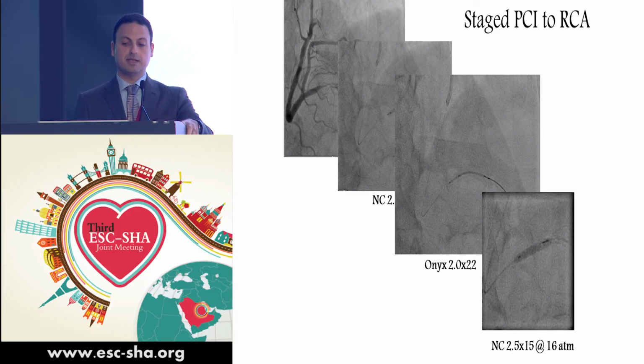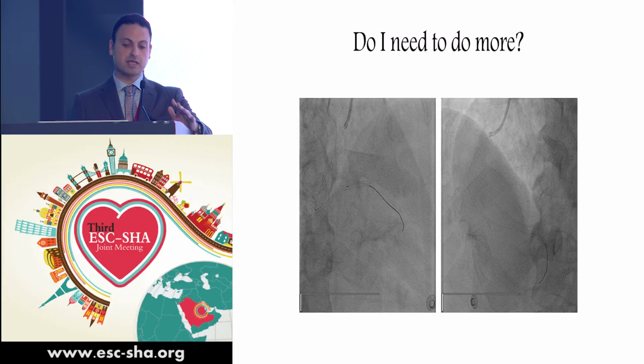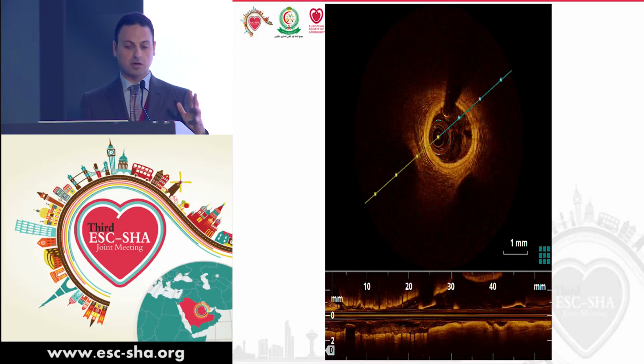And this is the result after stenting and post-dilatation. It looks fine. The patient is happy. My team is happy. You can stop. So coming to the question, do I need to do anything more? In such small vessels, especially when I'm using a very small stent, I prefer to do OCT to make sure that the stent deployment is perfectly okay.